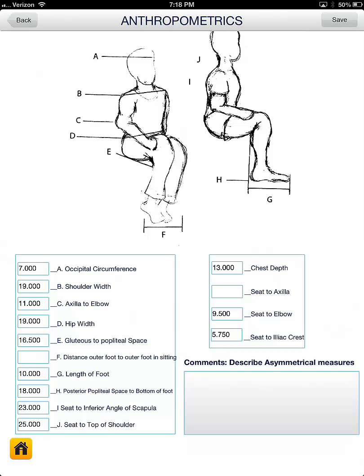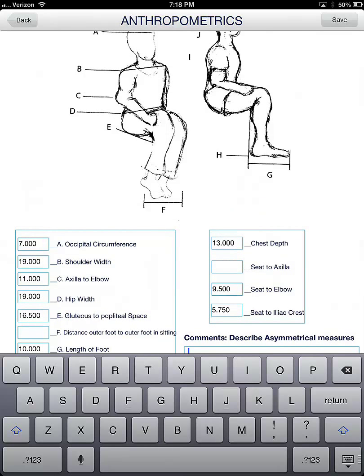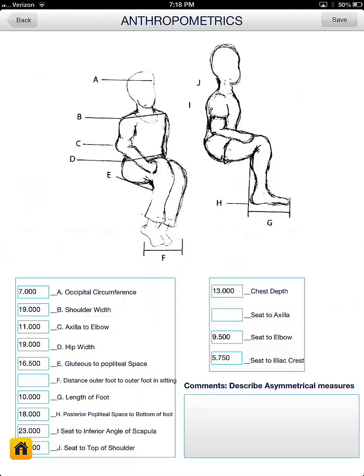And again, I find the use of the dictation tool very helpful. In this space, we found it useful to document what we would call a pre-detailed product description, just suggestive ideas that you might want to consider when you formulate your final order.